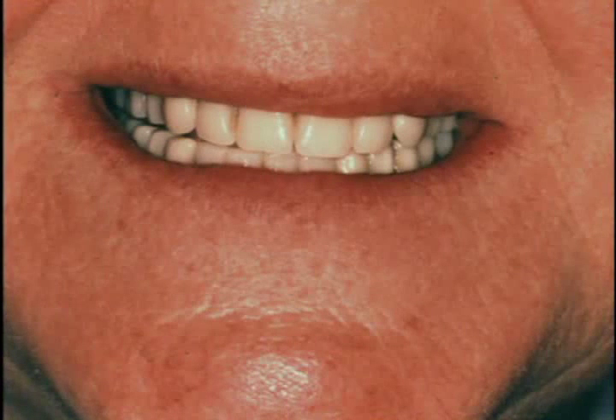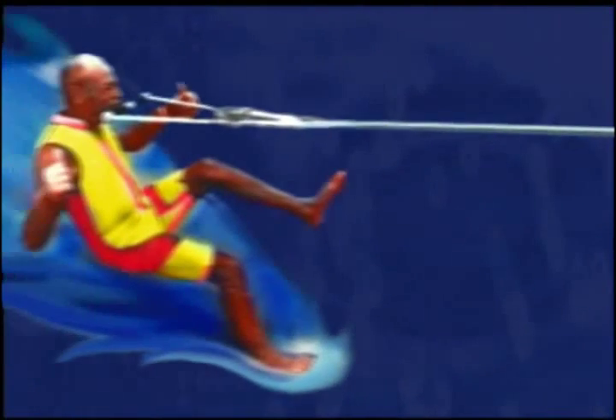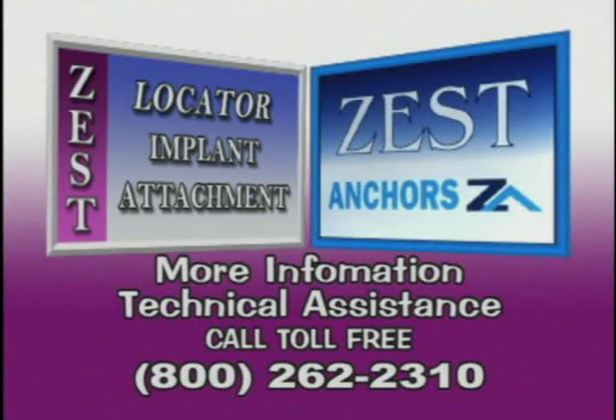A beautiful aesthetic result was achieved for this patient using the low profile locator attachments to retain the overdenture. With the incredible retention of locator overdentures, don't be surprised if your patients take up a new hobby. Additional information and technical assistance is available from Zest Anchors Incorporated by calling toll-free 1-800-262-2310.